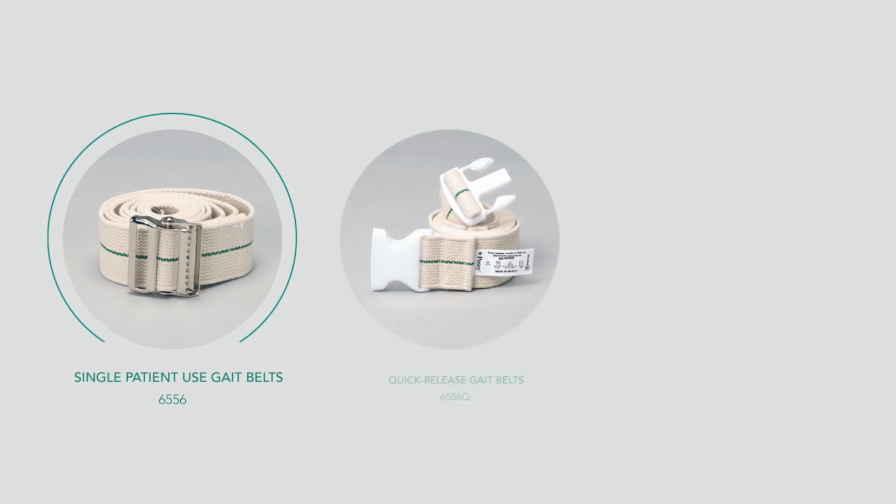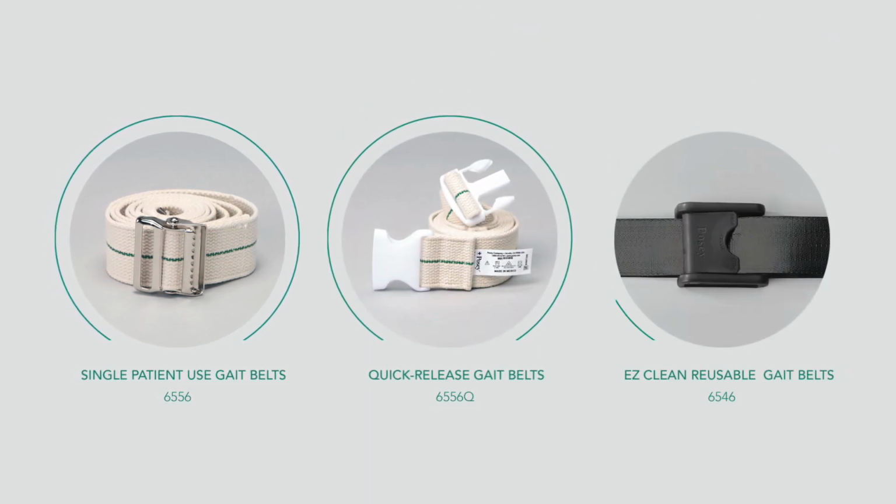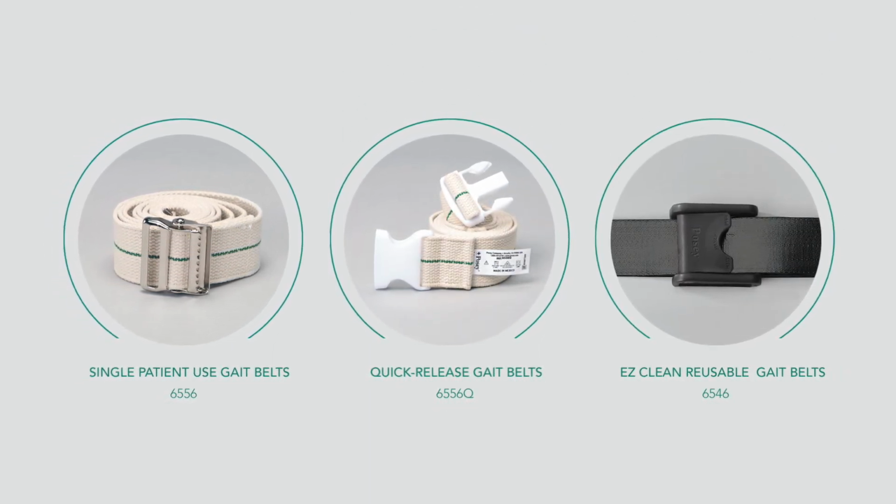Using gait belts is an essential element to a culture of safety in any healthcare organization. Gait belts provide a safe handle on patients when transferring from bed to chair, when transferring to stand to walk or ambulate. Falls are a leading cause of disability.